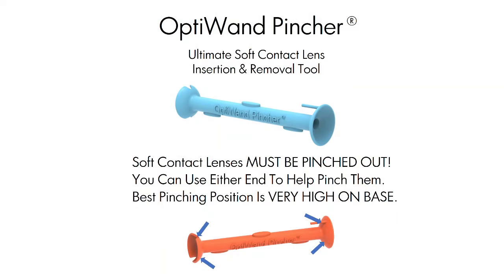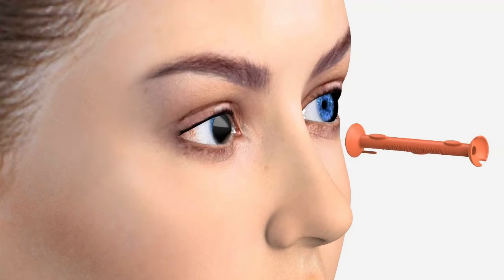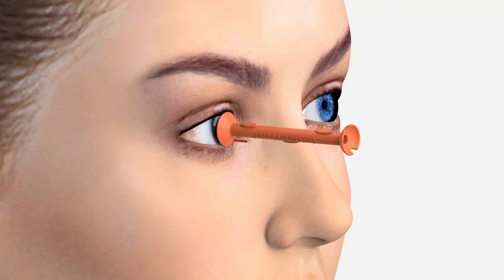Soft lenses must be pinched out. Best finger pinching position is very high on the base. Focus on the center hole and draw to eye. Twist slightly, then pinch the soft lens.